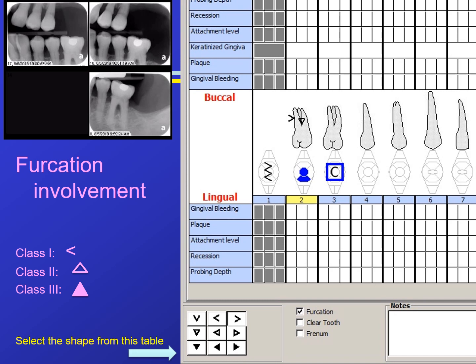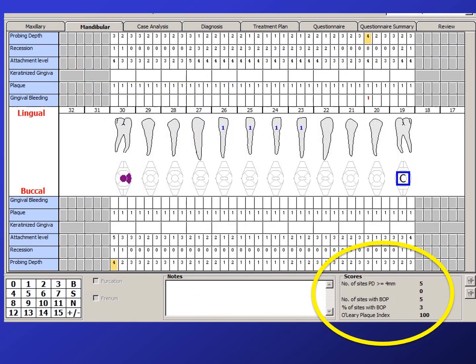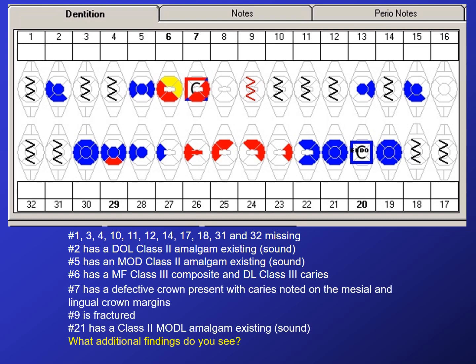Select the icon at the lower left-hand area of the screen. If there is no mobility, record a statement in the notes. If no areas of furcation involvement are detected, then make a note. If there is no note and no indication on the odontogram images, the assumption is that the operator did not assess mobility or furcation involvement. Salud summarizes your charting in this area. This slide can be used to check your knowledge about Salud symbols and naming the restorations. Information for the maxillary teeth is on the slide.